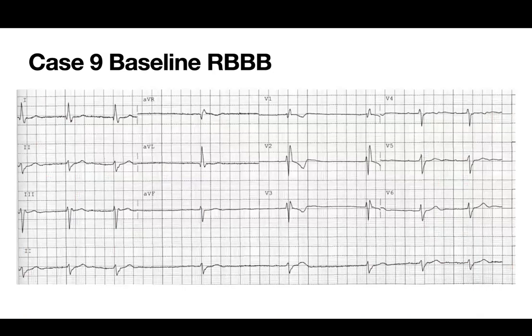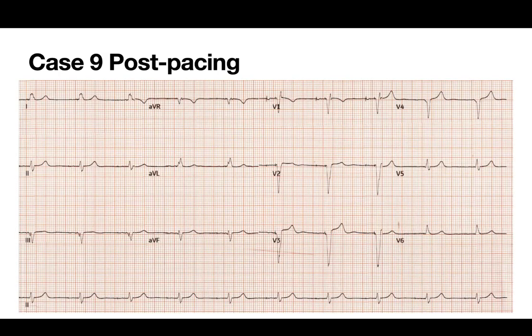I would look at the injury current and the impedance. My question is whether you're kind of apical. It was very mid-septal actually, a mid location. Lead two is a little bit positive, so you're not that low. But I would look at injury current and impedance now, and if I'm not convinced, I would inject and look at the fulcrum sign to see if it's deep enough.